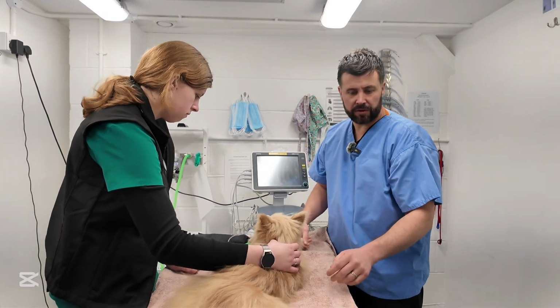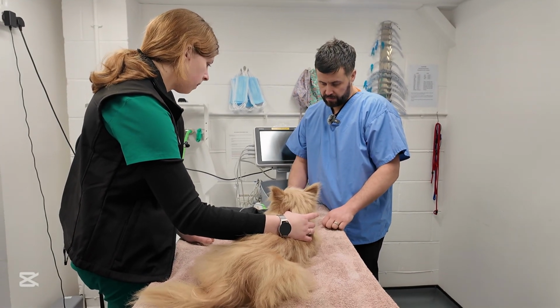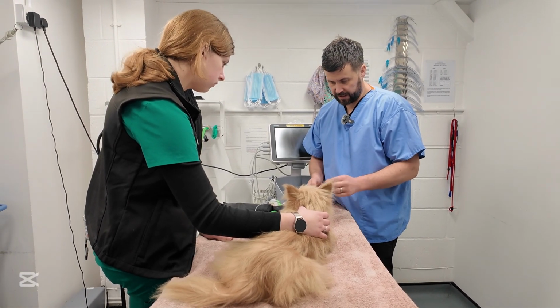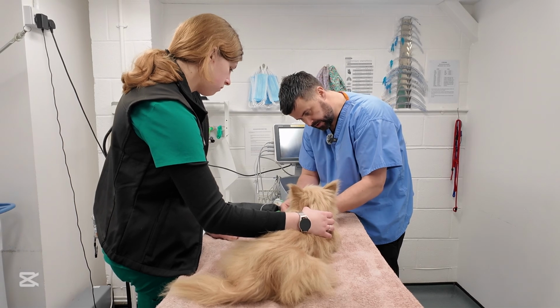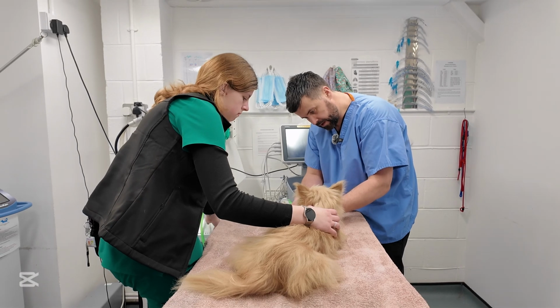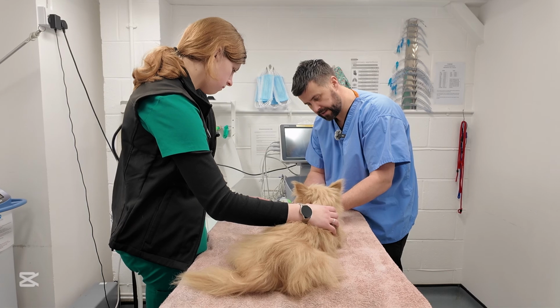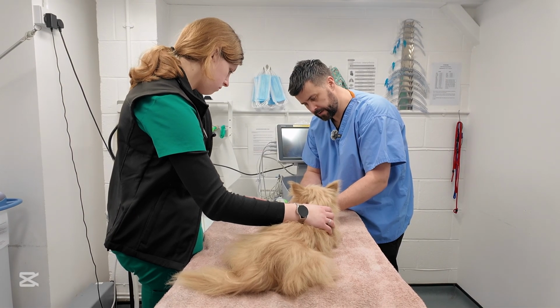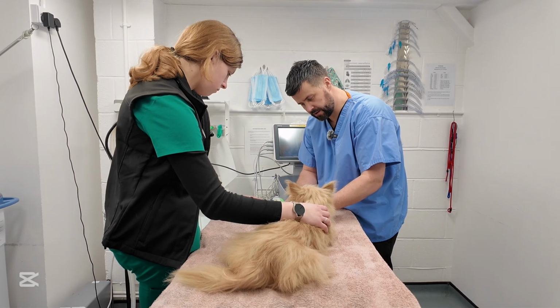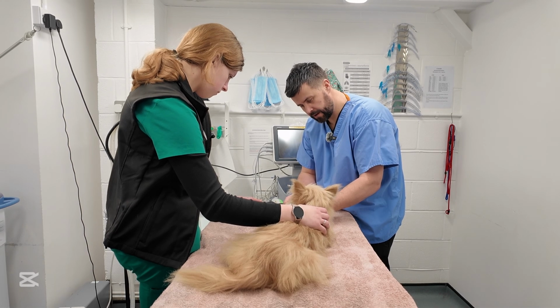So we're about to induce her. What that means is we're going to give her this propofol and induce the anaesthesia. She's going to feel really sleepy all of a sudden, and then same as I think you've seen before, we're going to maintain it with the gas. We do this so that we can get an airway to support her. I know, sleepy.